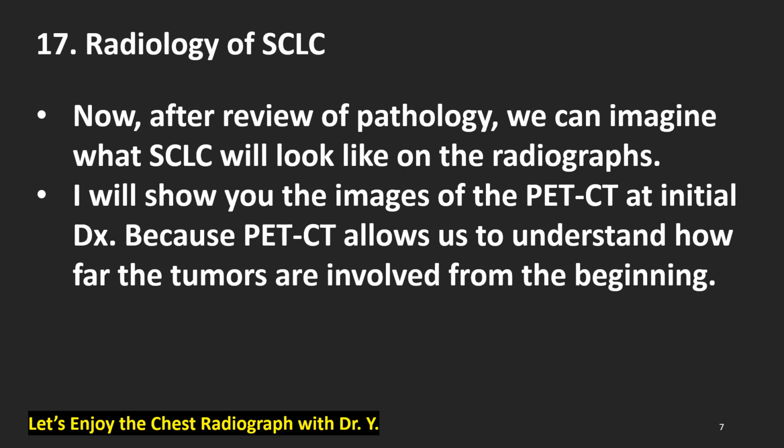Radiology of small cell lung cancer. Now, after review of the pathology, you can imagine what small cell lung cancer will look like on the radiographs. I'll show you the images of PET-CT at initial diagnosis, because PET-CT allows us to understand how far the tumors are involved from the beginning.